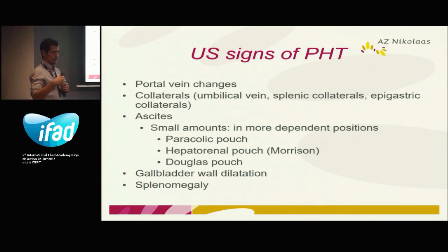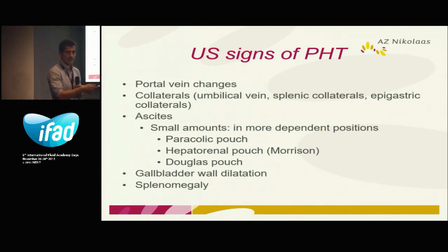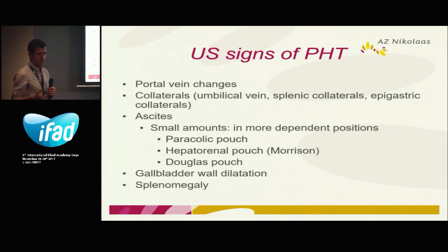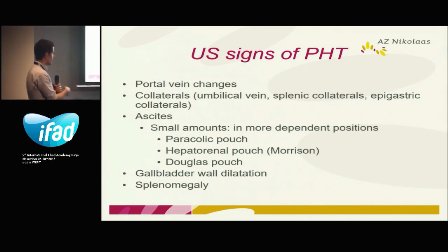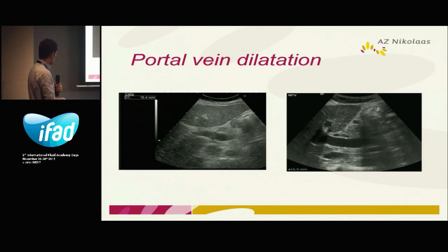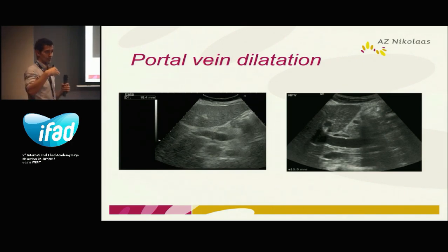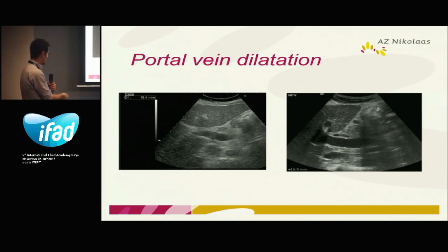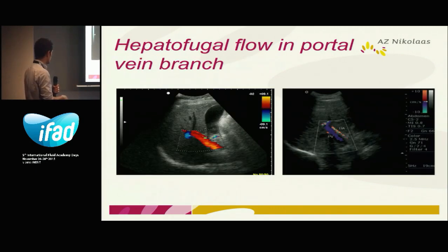If liver cirrhosis is quite severe and the patient has, for example, thrombocytopenia, we can have signs of portal hypertension. The signs of portal hypertension are: splenomegaly, ascites, and collaterals. Portal hypertension means the tension in the portal vein is too high, leading to dilatation of the portal vein. Here you see a clear dilatation of the portal vein.